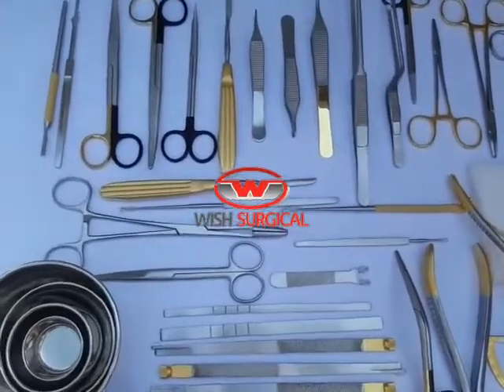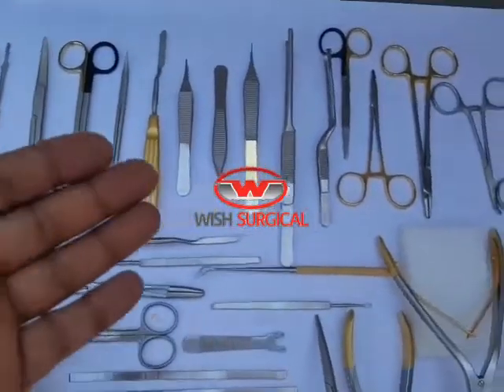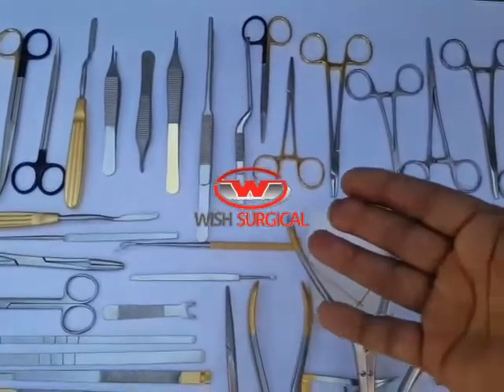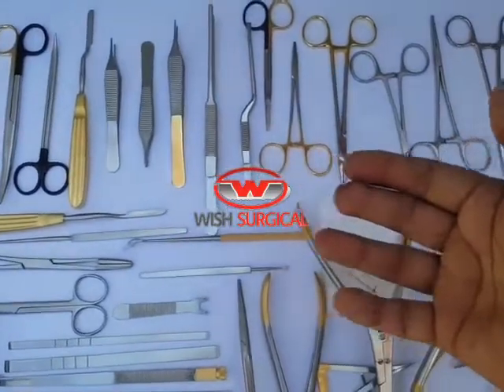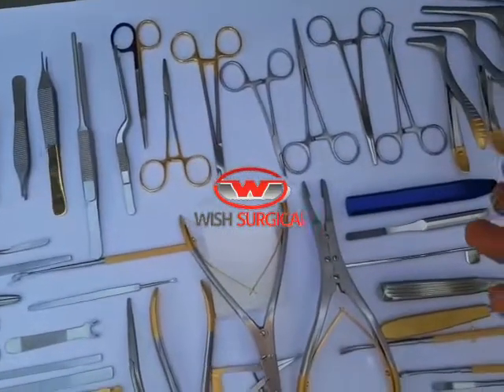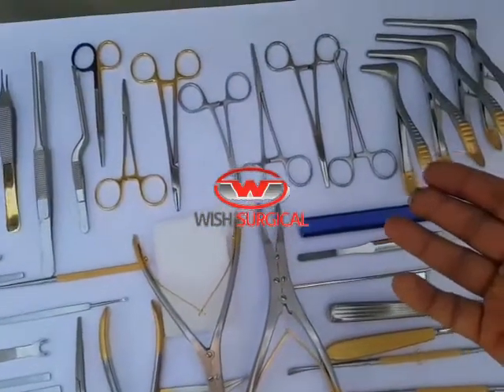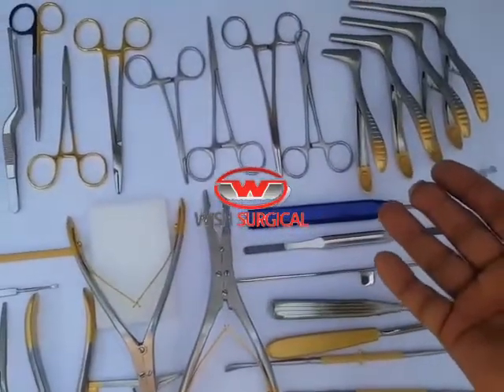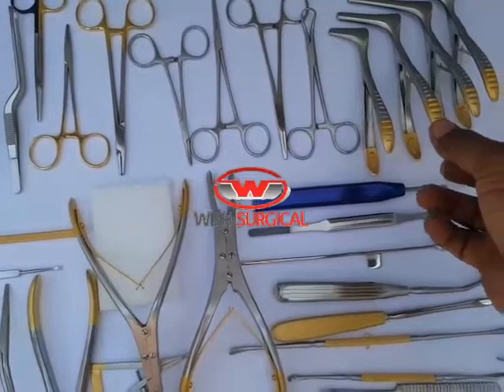Here you can see two types of scalpel handles, some new scissors with TC supercut inserts, TC Adson forceps, Adson tissue forceps, Adson Brown forceps, also a needle holder with TC supercut inserts.